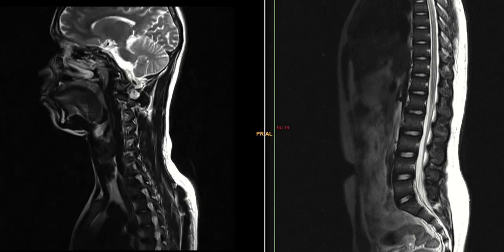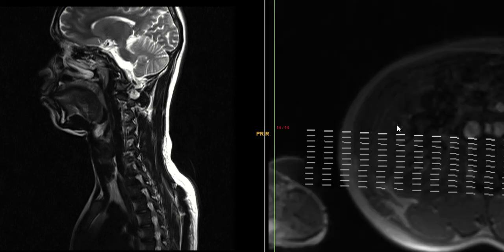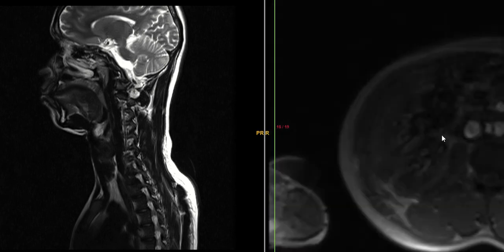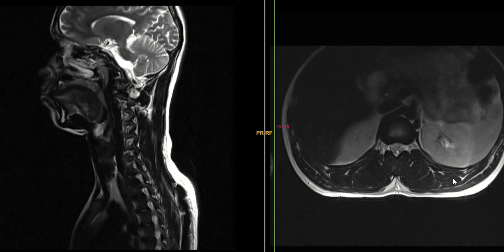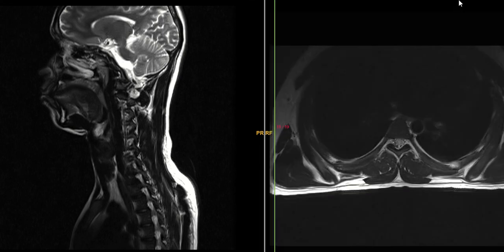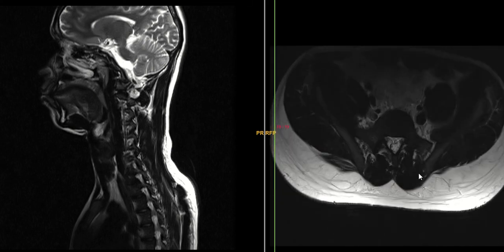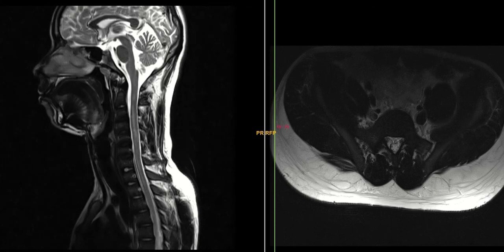We have axials for the lumbar — alright. There is a bit of syringomyelia as I had suspected, and nothing else actually. That's it, thank you.